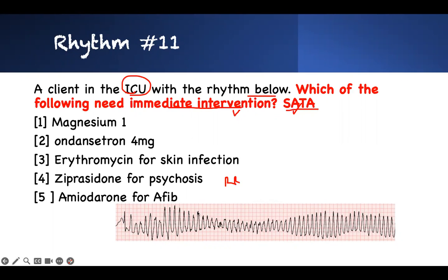RR interval, right? You go from here, I see RR, but it's all over the place, right? You look like uniform, but it's changing in shape. Change in shape, keywords. You can calculate RR. The heart rate is also greater than 150. You can see from here, it's just one or two, right? I can't even see P wave, so I know it's not an atrial problem. There's no P wave, so it cannot be atrial.